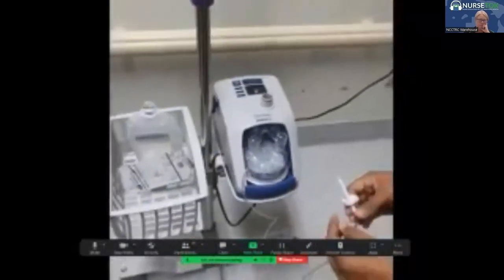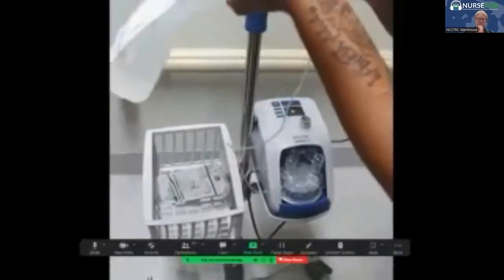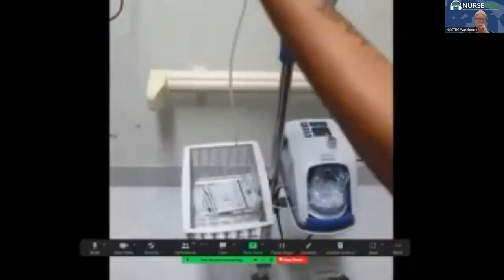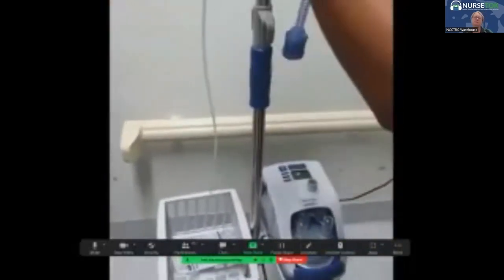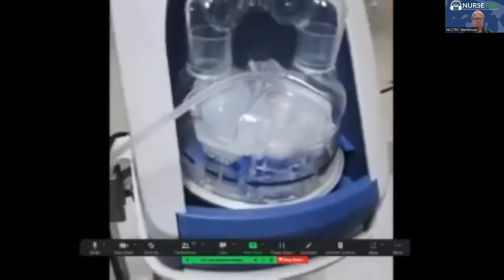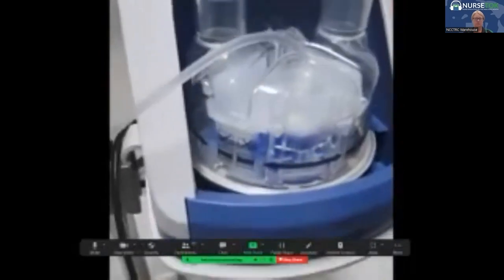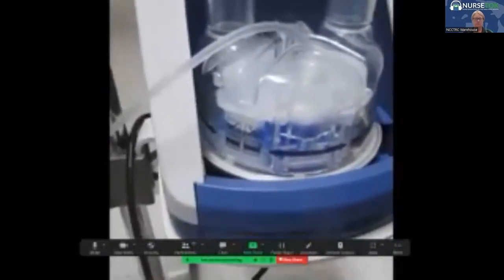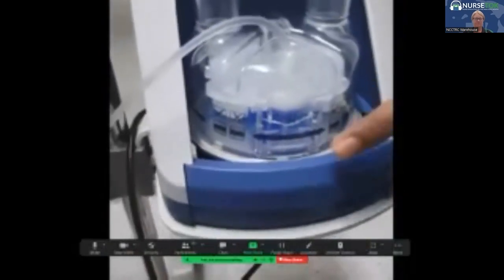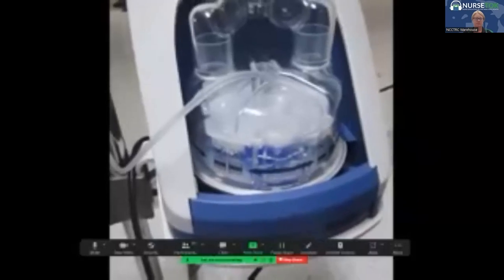So once that is done, we'll attach the water supply tube spike into the bag of our sterile water. Cap on the side of the bag spike. And then we'll ensure that the bag of sterile water is 20 centimeters above the humidifier. And while checking on this, we'll be checking to see if water is automatically filling into the chamber. If it rises above the water level line, then we'll need to replace the chamber with a new one.